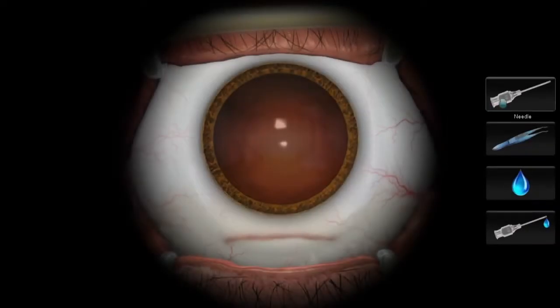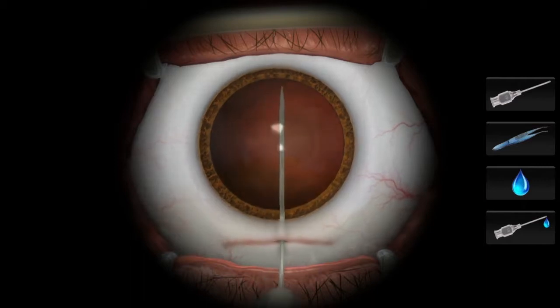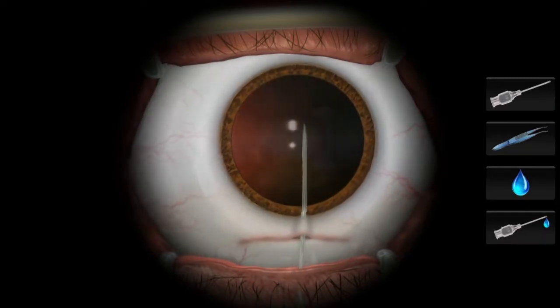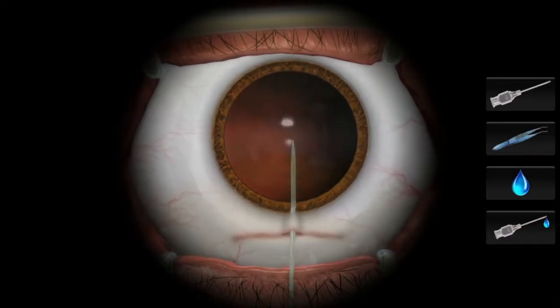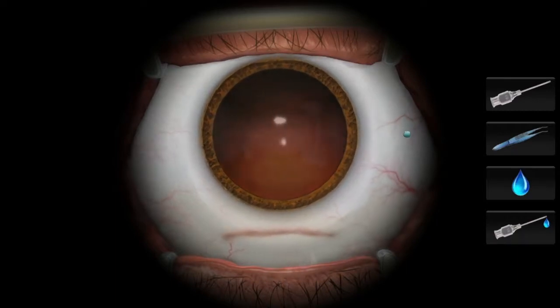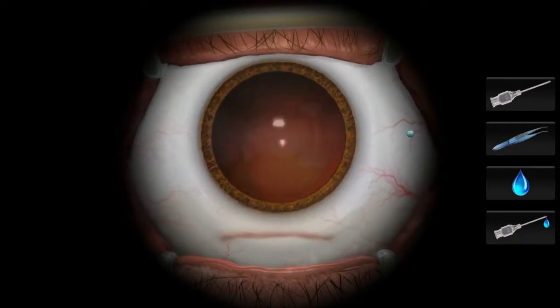The cutting of the capsular bag is one of the important stages in the surgery. When the eye is fully dilated and the red reflex is visible, the surgeon can insert the cystome into the eye and begin using the sharp point to gently tear the capsular bag. If the surgeon has forgotten to use forceps to keep the eye stable during surgery, the eye will roll with the force of the cystome, and cutting the capsular bag will be difficult, dangerous, and is not recommended.